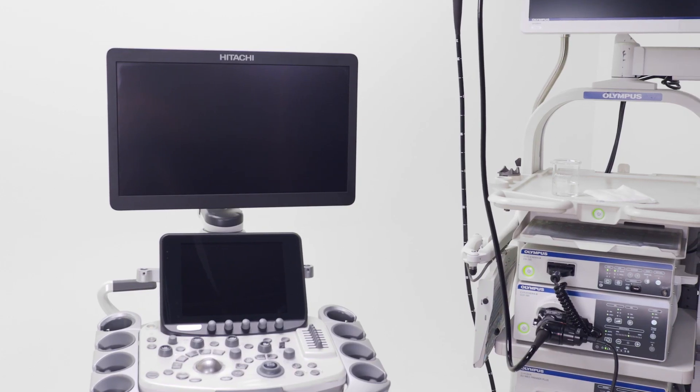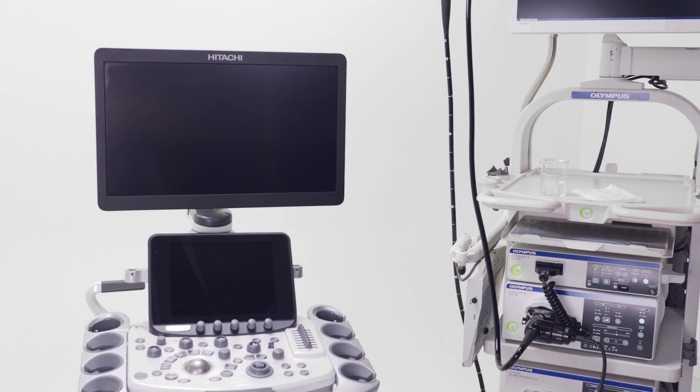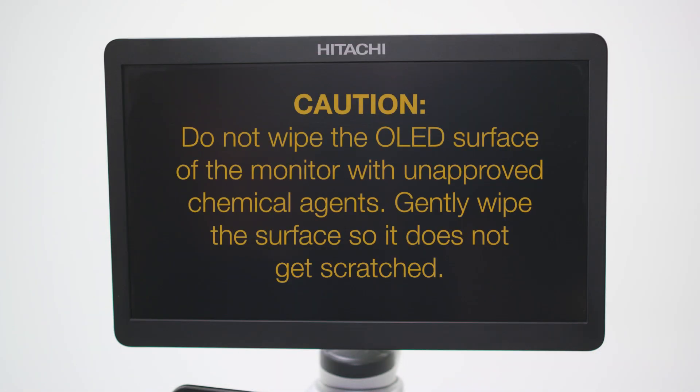This video will review how to clean the monitor on the Arrieta 850. CAUTION: Do not wipe the OLED surface of the monitor with unapproved chemical agents.